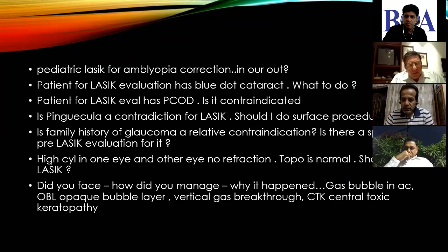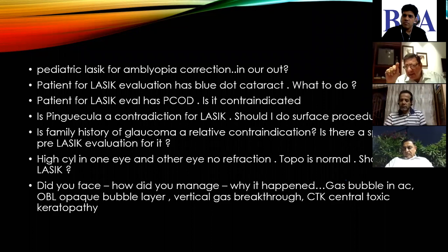When you get a free flap, your flap margin is not going to be perfectly circular. There is going to be some zigzag, in a very microscopic way, some slight indentation somewhere where the hinge was supposed to be.